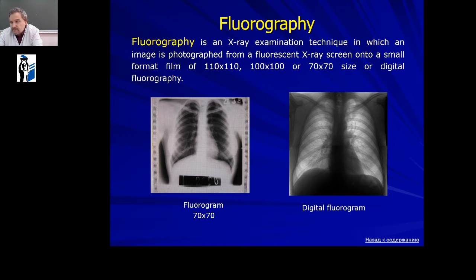The next method of X-ray examination is fluorography.